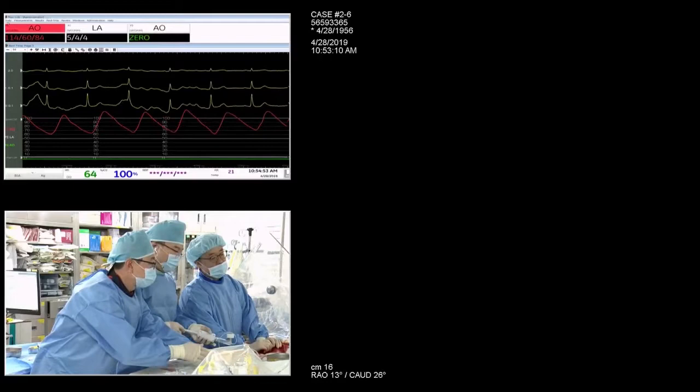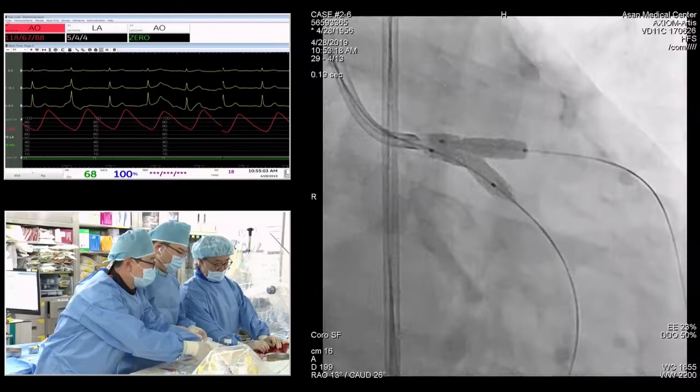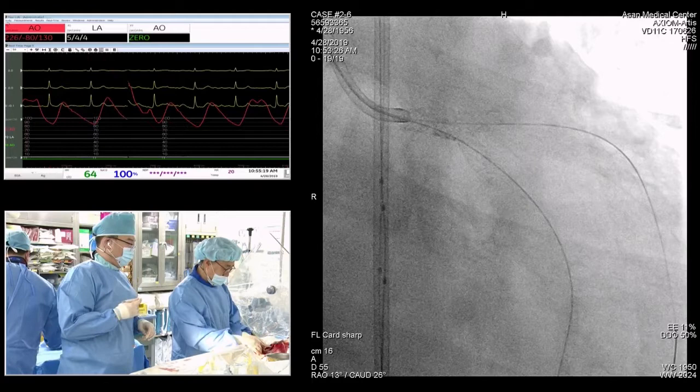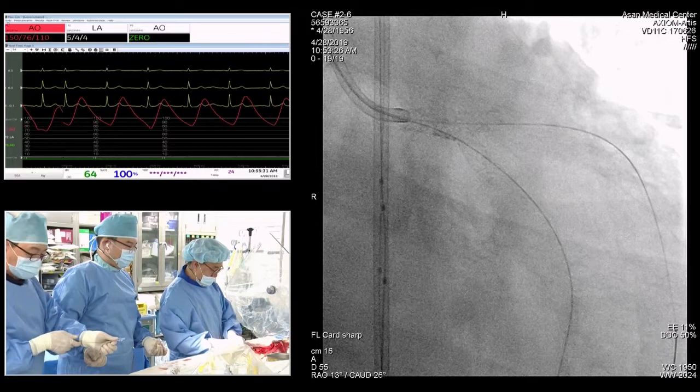I'd like to ask the panel, if I were to tell you to do a high pressure inflation, what does high pressure mean to you? Give me a number. It depends on the balloon size, but give me a general number. 14. 20. Non-compliant 20. I say high pressure to me is 20 to 24. 22. So the range is from 14 to 24, but not 12. 14 to me is low pressure. Okay, got it.